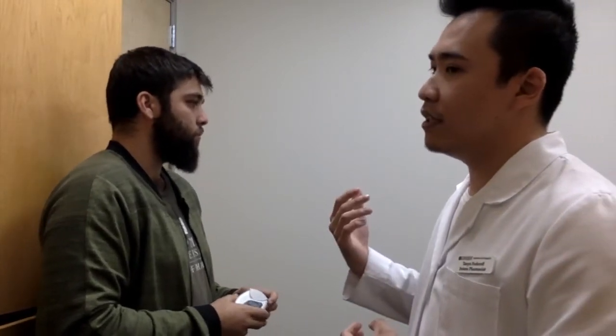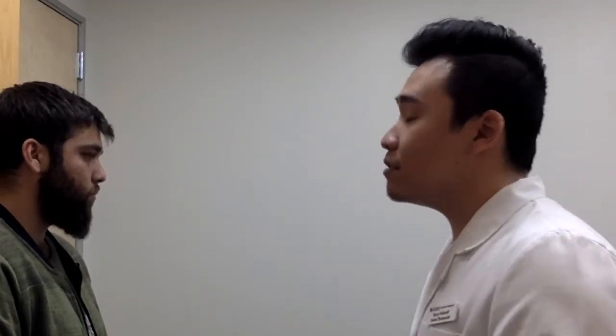The Anoro Ellipta is a prescription inhaler used long-term to treat COPD for better breathing. It contains 62.5 micrograms of umeclidinium bromide and 25 micrograms of vilanterol trifenatate, which work together to improve lung function. Some patients may have difficulty using this inhaler. Would you mind showing me how to take this medication? Sure.